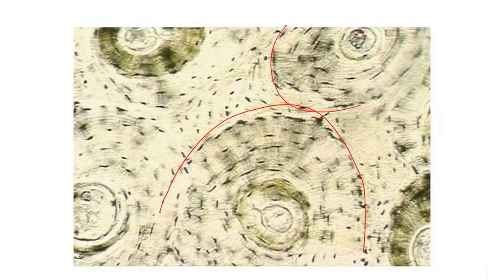Large osteons, central canal in the center, the rings of lamellae, the concentric rings heading out toward the edge of the osteon. The little black spots here are the osteocytes. And if you could see, maybe here, these little rivers or the canals connecting those are the canaliculi. The brown stuff in the picture, the background, is the hard, bony, calcified matrix. So remember, bone is connective tissue. You're looking at connective tissue, but this specifically is bone found in the skeleton, in the bones.